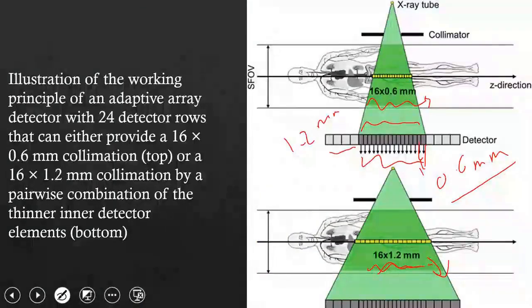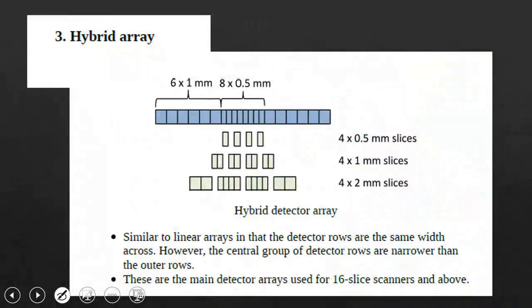The hybrid is like the example we were talking about, which is the idea that I don't have different sets or different sizes. I had this linear, everything like some adaptive. You have a set, meaning every 2 rows, for example, I have a certain configuration here.